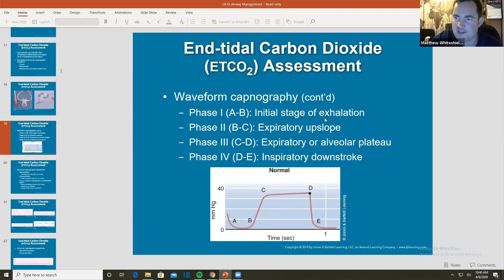A to B, initial stage of exhalation. So right before we exhale and then start exhaling. B to C, expiratory upslope. Expiratory or alveolar plateau. This plateau is extremely important. And what I mean by plateau, this flat top on these waveforms, that's what we're looking for. And then the inspiratory downstroke. I want to see this plateau that goes up, across, and then down. And I'm going to start showing you some waveforms that look a little different.